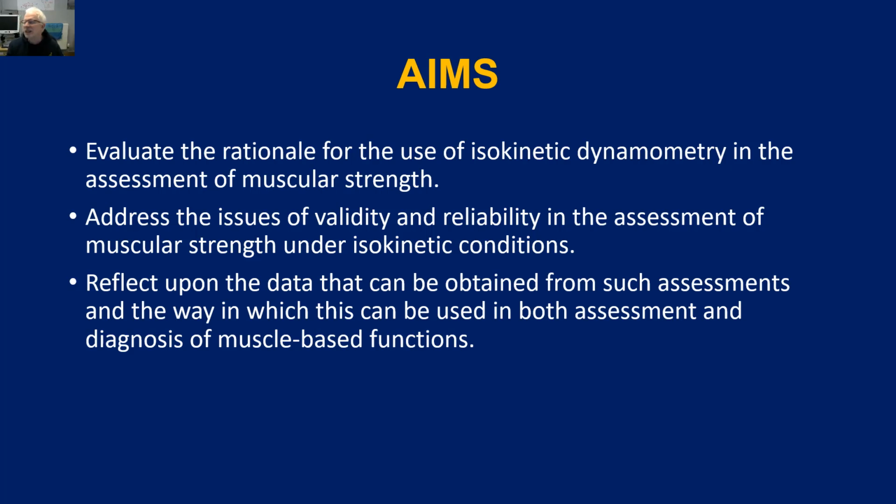But particularly with isokinetic dynamometry, as you will discover, it's quite complicated in terms of the way in which we set the device, the dynamometer, up. And understanding the setup can actually have big ramifications both on the validity of the data, are we getting what we think we're getting in terms of the outcome, but also in terms of the reliability. We have to understand about that notion of having accurate setup procedures.